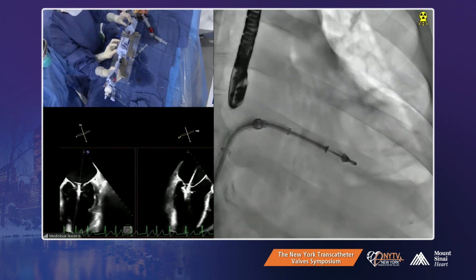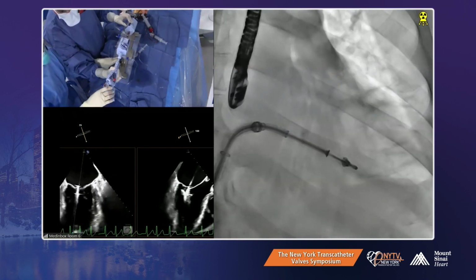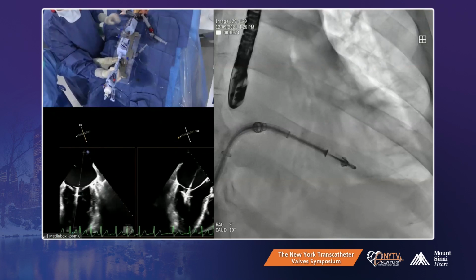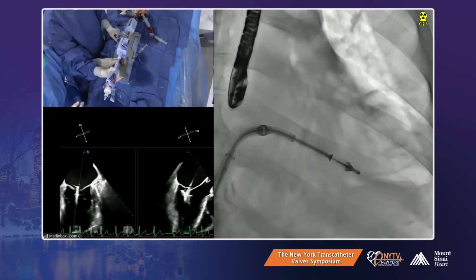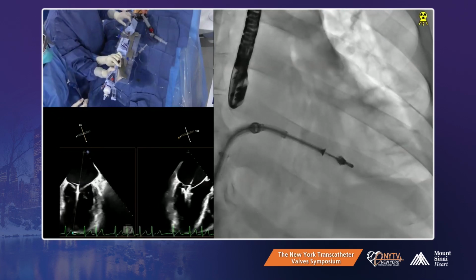When you miss anterior like that and you consistently get posterior, I worry that your orientation isn't as good as you think it is. Yeah, we just checked it, Howie, on fluoro and on echo. So they said it was okay. It was like on 12.6, but we can counterclock a little bit, as you said.